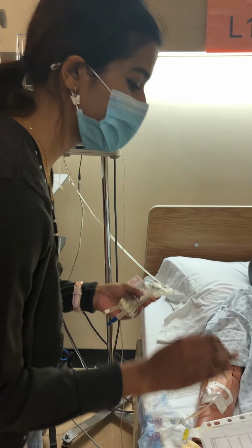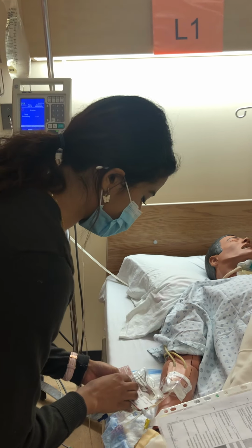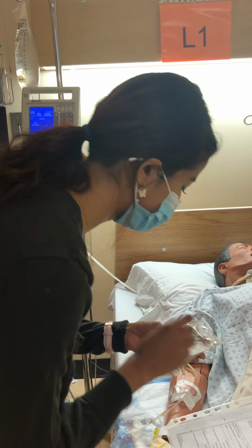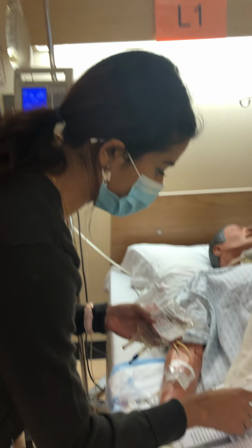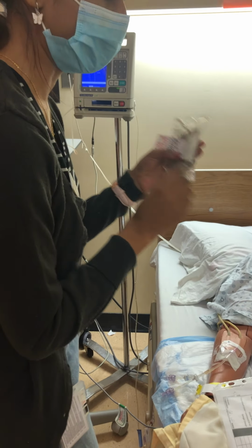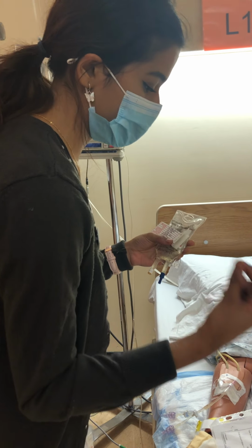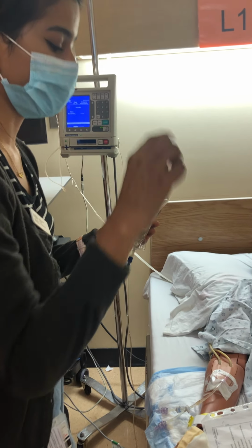They don't have any allergies, so I'm going to continue on with my third check before I go on to educate the patient. So we have the right drug. We have morphine, and the right dose, 1 milligram per ml. So according to the PDM, I have 50 milligrams in this bag because I drew them up from the vials of 10 milligrams per ml concentration. So I drew up 1 mil from each of the 5 vials.